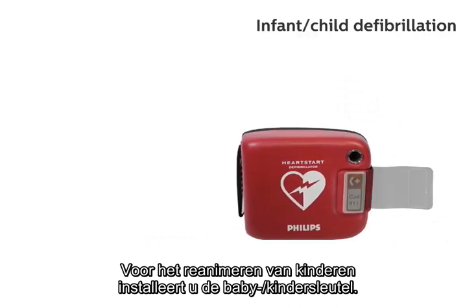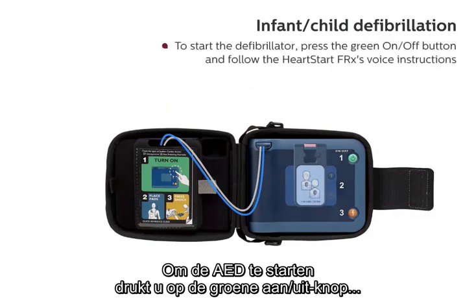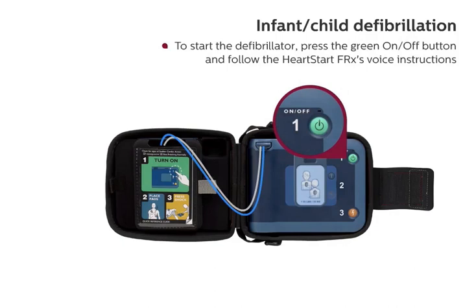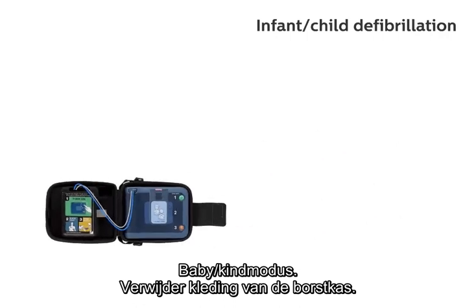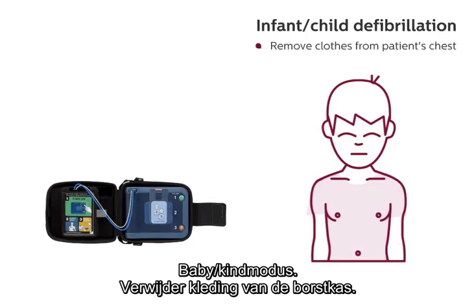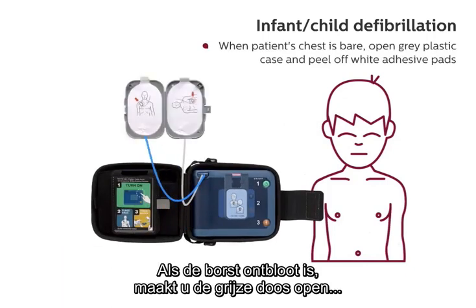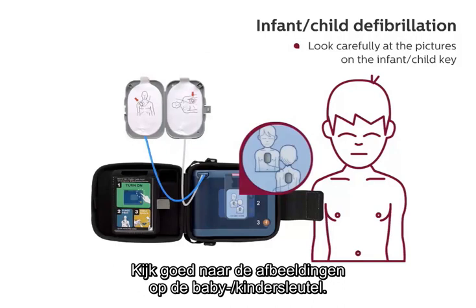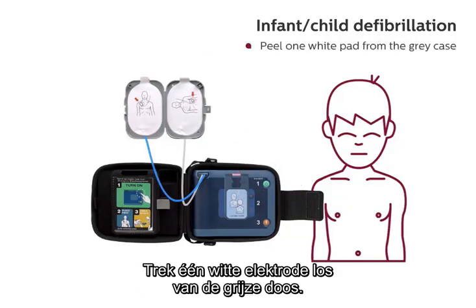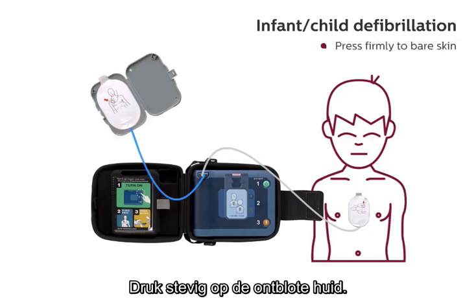To initiate infant-child defibrillation, insert the infant-child key. To start the defibrillator, press the green on-off button and follow the HeartStart FRX's voice instructions. When patient's chest is bare, open the gray plastic case and peel off the white adhesive pads. Look carefully at the pictures on the infant-child key. Peel one white pad from the gray case. Place pad in center of child's chest. Press firmly to bare skin.